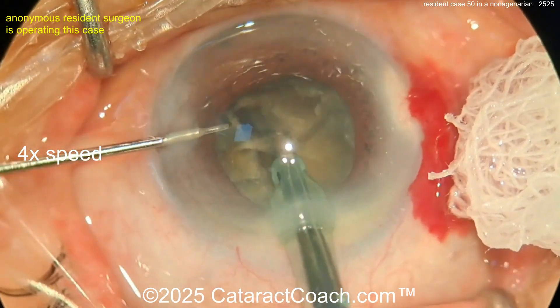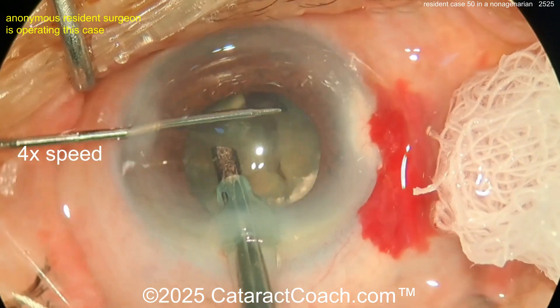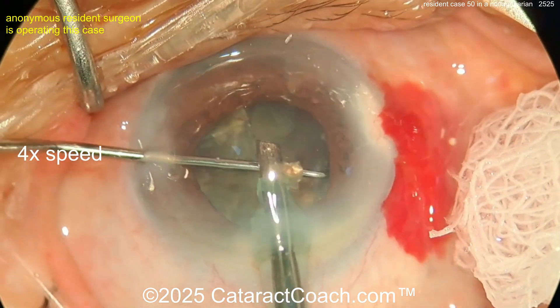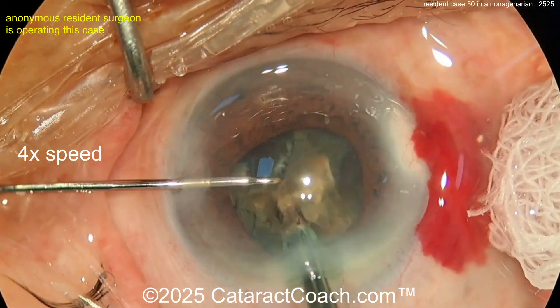That's a good chop. You certainly have great hands for case 50, and it took you 30 minutes — you obviously know some principles of chop, how to move within the eye, you got a good incision, a good rhexis. The draping is tolerable. There's a lot to learn here.